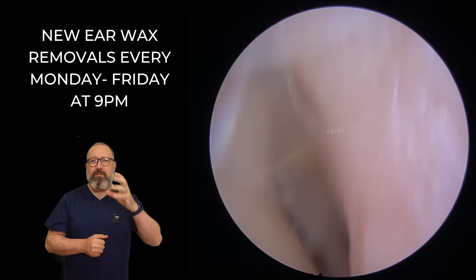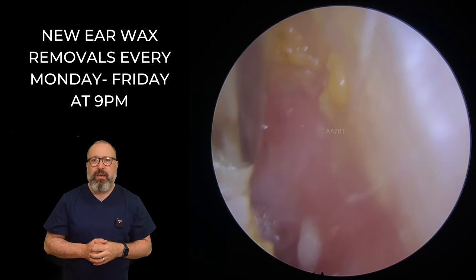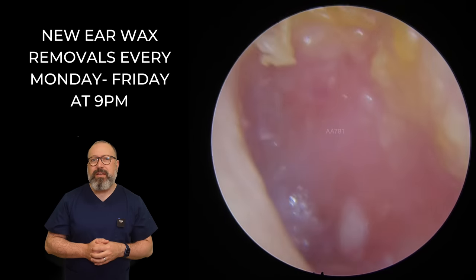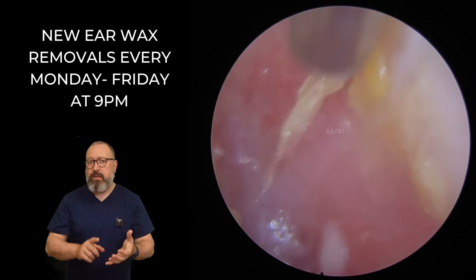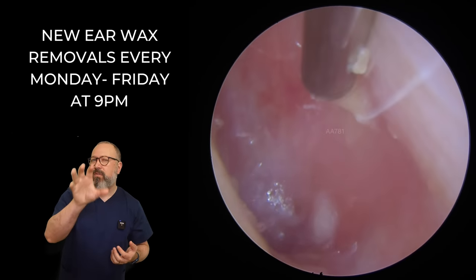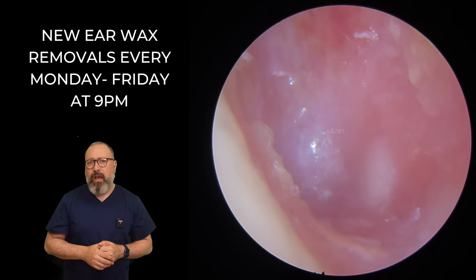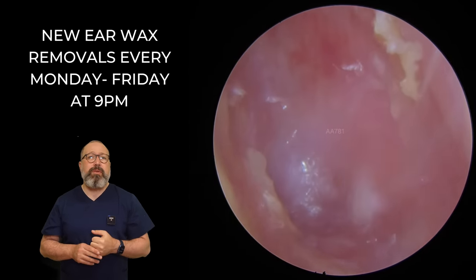You can see the eardrum itself — very, very difficult to make that out at all, in fact. So we're just going to tidy this up. Now, there's a possibility — I think this is more likely the beginning of a false fundus. Because what I can see there, there's no obvious markers for the eardrum. We can't see any tip of the hammer bone, we can't see anything there. This looks more like a false fundus to me, which would tally up with that really hard, thick epithelial layer being just down inside the ear canal. So this patient we've referred on back to the GP for referral to ENT. We want to get them checked out — more than likely have a little MRI scan just to check out what's going on beyond that as well.